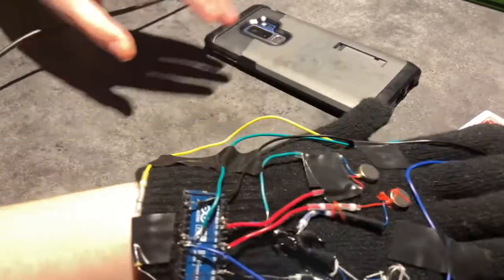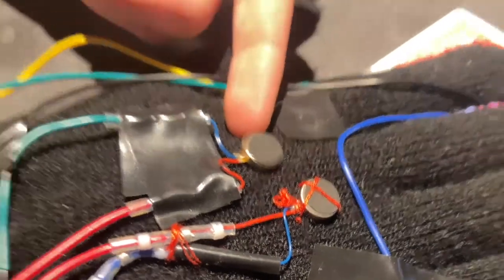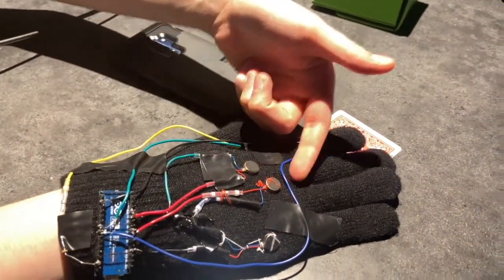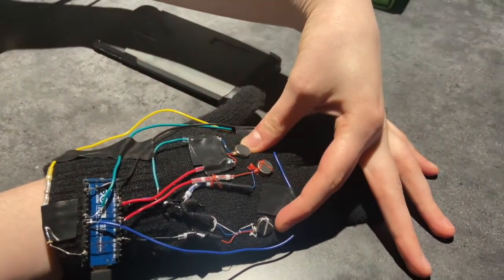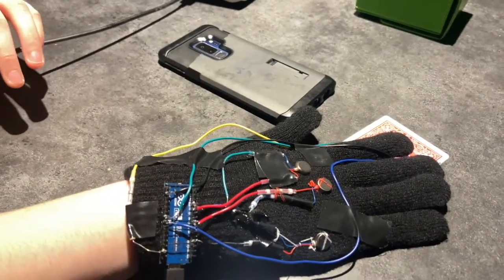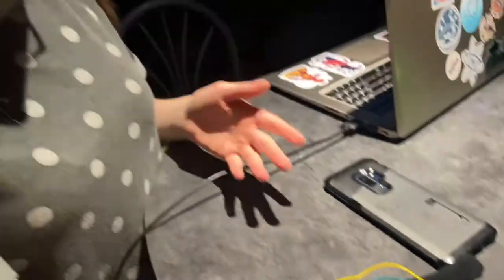Right now, when I put this over the red card, you can see that the red motor is vibrating. This motor vibrates for red, this one vibrates for green, and this one vibrates for blue. A combination of these two does yellow, and a combination of these two does purple. We actually don't have a combination for cyan because we realized that most people, when seeing something that would be considered cyan, would see it more as just either a green or a blue, not a very specific shade of turquoise that would be considered cyan. So we decided it was redundant because we couldn't even agree on what the value would be amongst all of us, so we don't have it included.